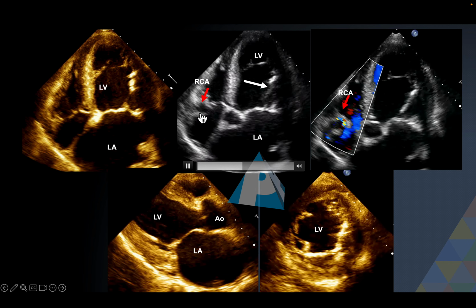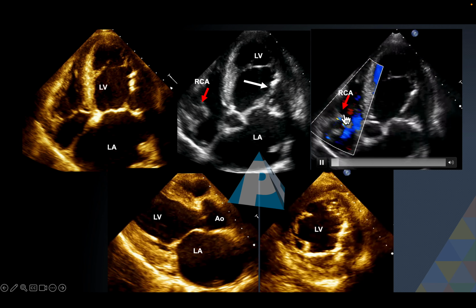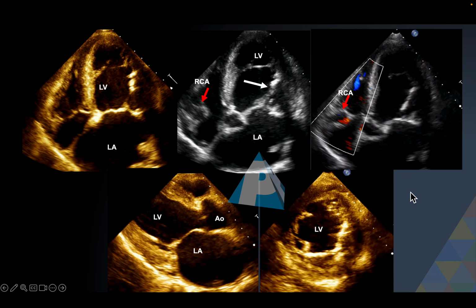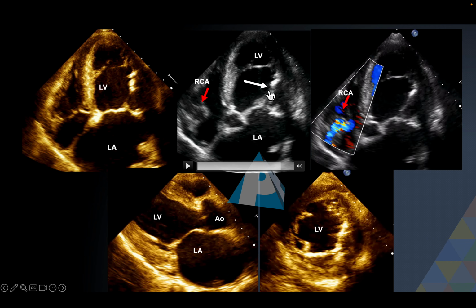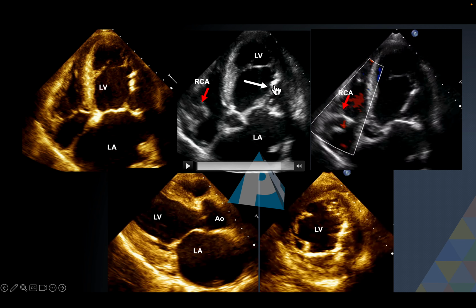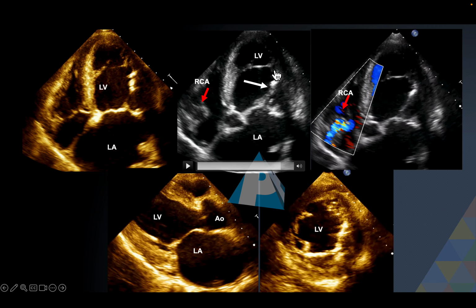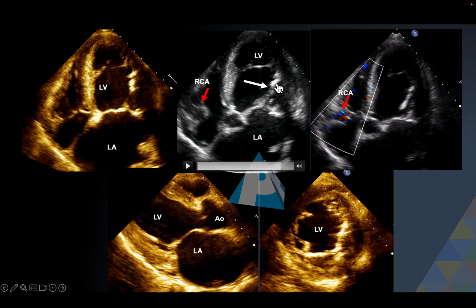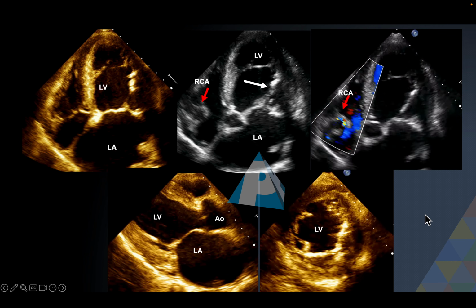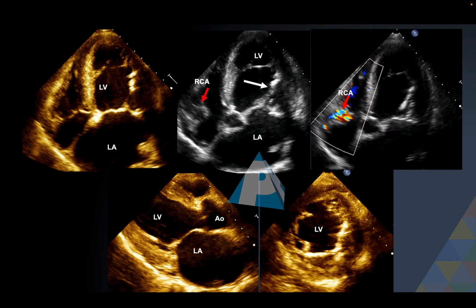You see a large circular structure which is the right coronary artery, and confirmed on color Doppler you see the aliasing there. So now his situation up till here is that dilated LV with a little more hypokinesia of the apex. You have scarring of the papillary muscle with calcification, and immediately then you have a right coronary artery dilated. I think there's hardly any differential. This is a patient of ALCAPA.